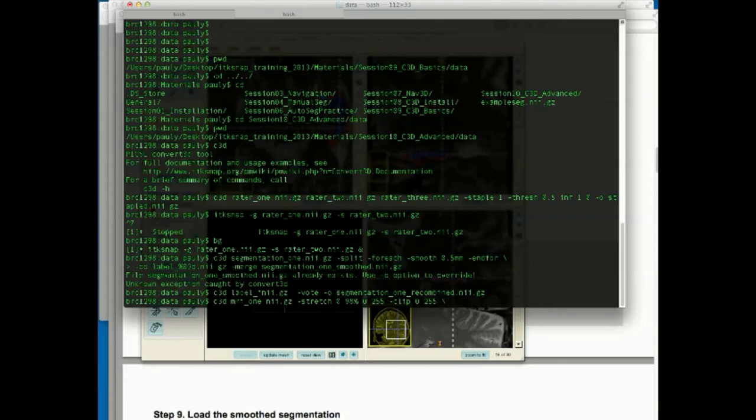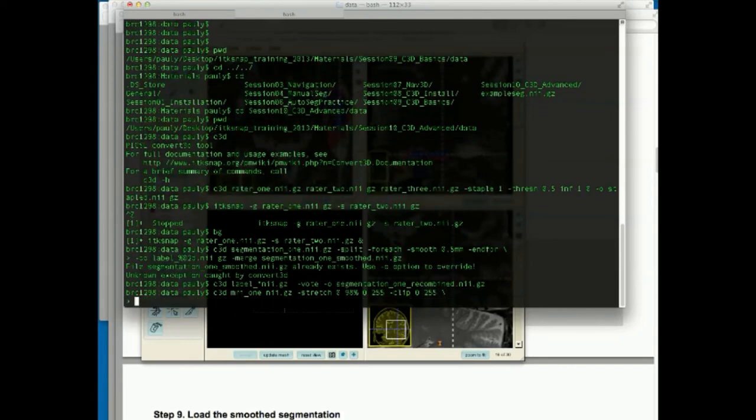Yeah, so that looks nice when you're doing it in SNAP. But now you can do this automatically to produce the figure. So now we have that nice looking image. You can load up how that looks by writing it out, MRI1 stretched clipped. I'm not going to load it for the sake of time because we have only 5 minutes, but you can load up that image and see if that contrast looks a little bit better.